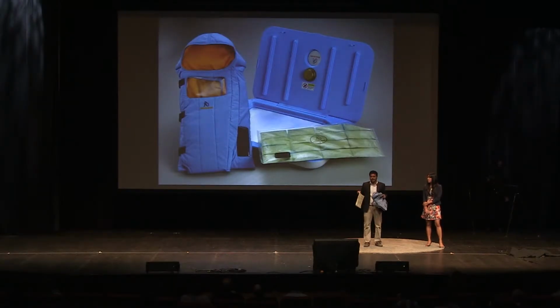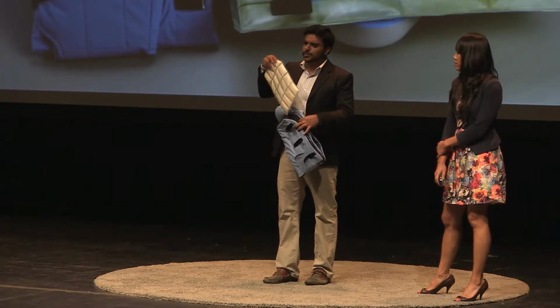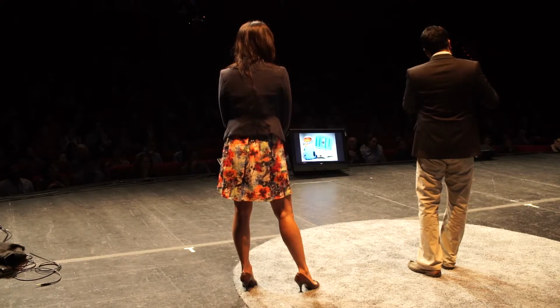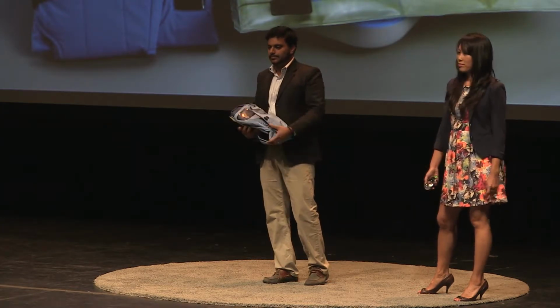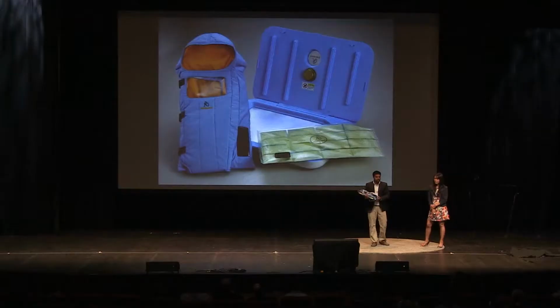Once you heat it, and you can heat it in a heating device that can work with intermittent electricity or hot water, most places in the world can have access to hot water. Heating takes about 20 minutes. You pop it into this sleeping bag-like device, and the baby basically rests in it. Once the baby is in this, it will stay warm for about 8 hours. And the baby can be next to the mother. There's no electricity anywhere near the baby. And it's something that can reach the lowest levels of the healthcare system.